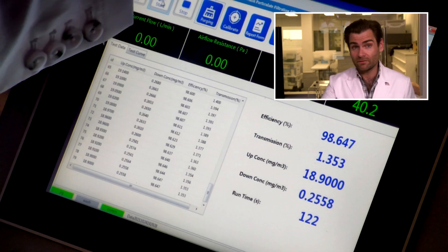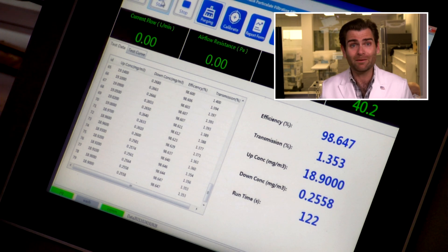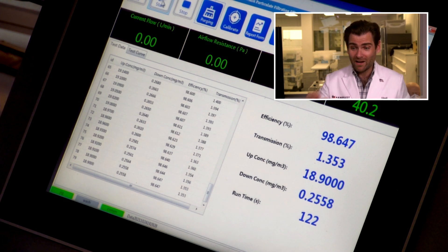Does comfort matter if it doesn't protect you? Let's look at the PFE machine — this is a great score: 98.647%. Not the best score we've ever had, but breathability is absolutely off the charts. It's a great mask.